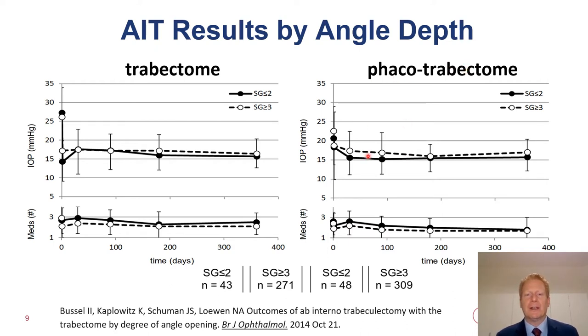This is surprising because naturally you would think removing the cataract in those eyes with a narrow angle would deepen the angle and improve outflow. Well, this study shows that this is not the case, and the number of our patients here was quite sufficient to be convinced.